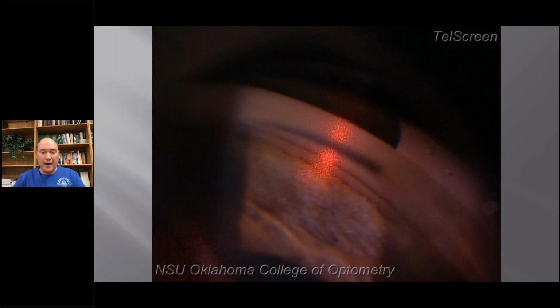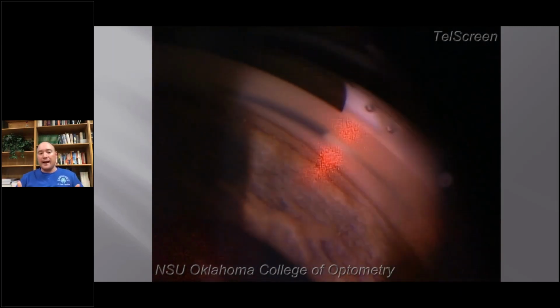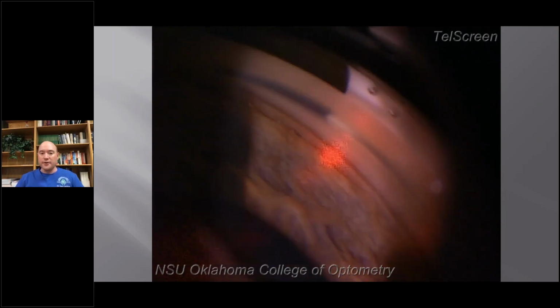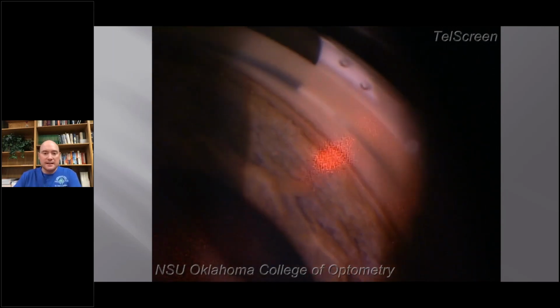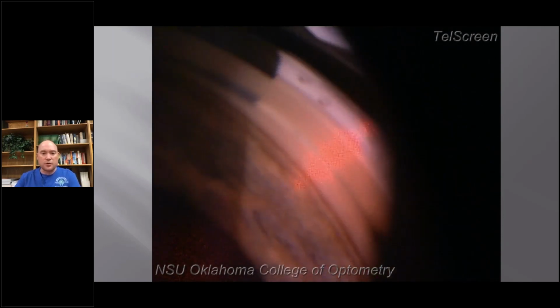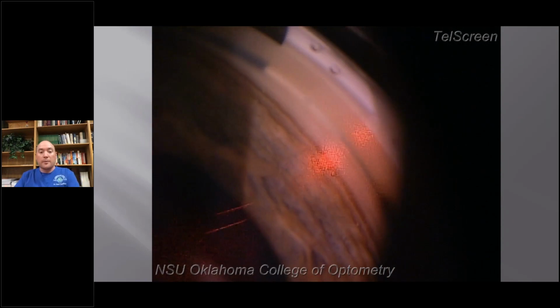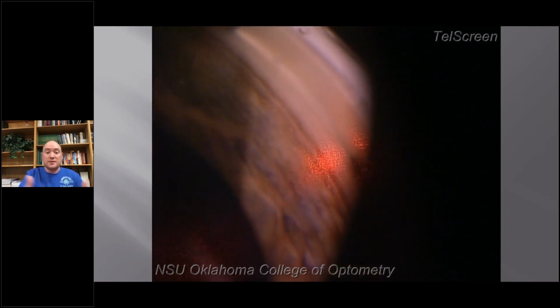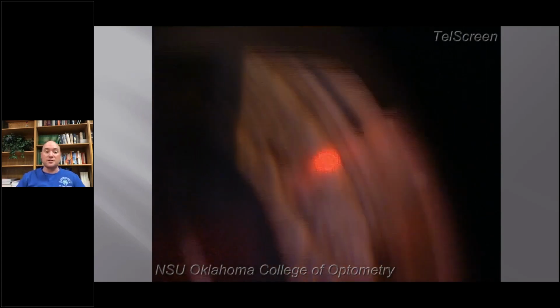And we'll just watch about half of this one here as we go along. Again, I started at 9 o'clock. Where are we at now? We're at about 1 or 1:30. Just going along. Notice you don't see any laser burns. There's no pits. There's no craters. You actually cannot tell any difference between where we're about to treat and where we just treated because there are no landmarks in terms of laser damage to the tissue that you're treating.